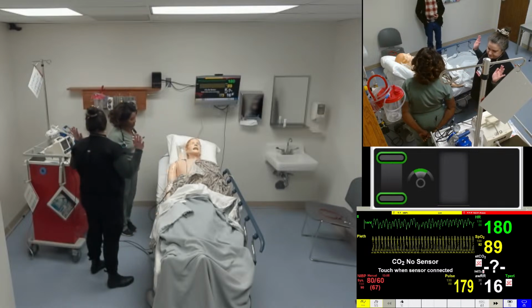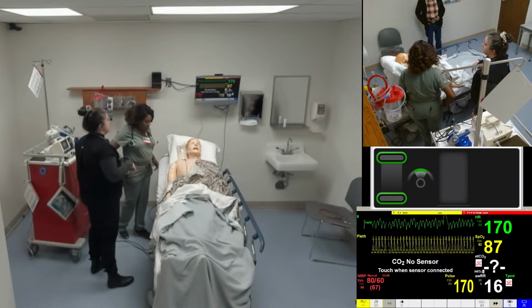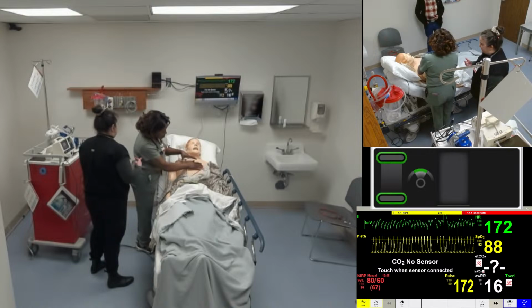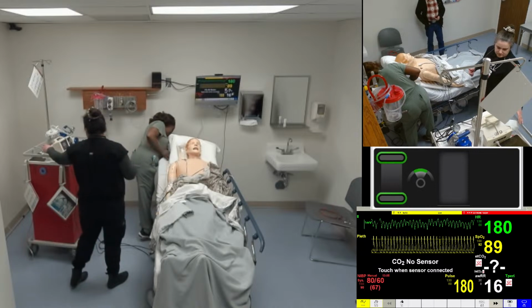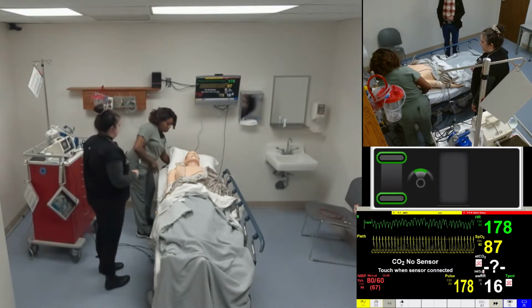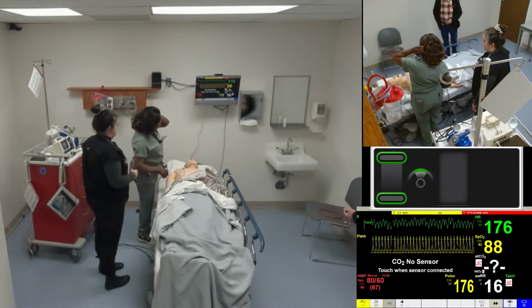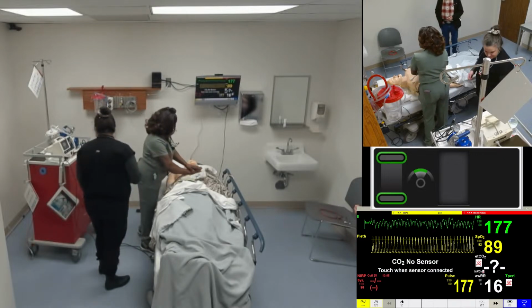Stand clear. Push to shock. Start CPR. Oh, we're not doing CPR. That's unfortunate for this guy. Is that all? Why aren't you doing CPR? Because we need to lower him down to bed. You can do CPR now. Stay there. Yeah.